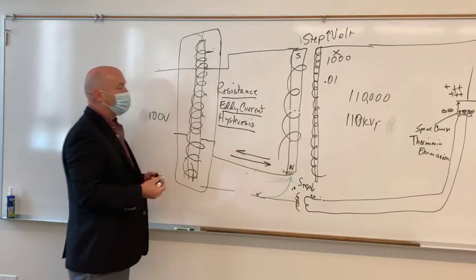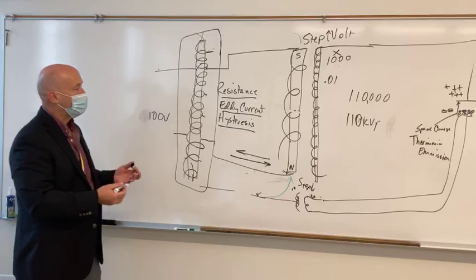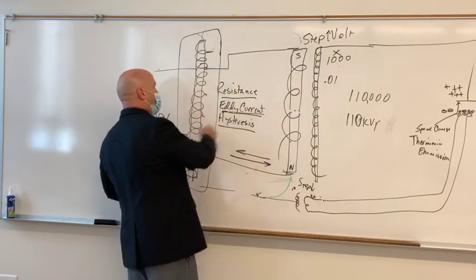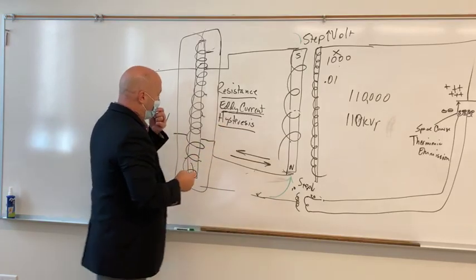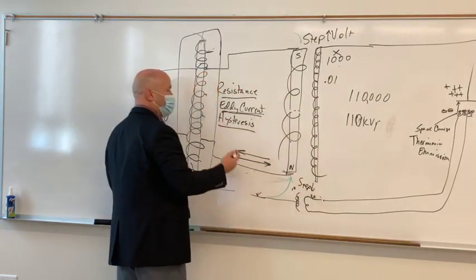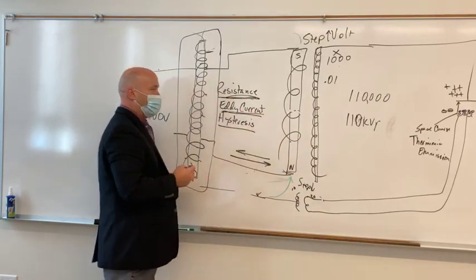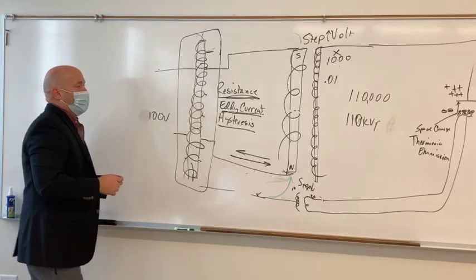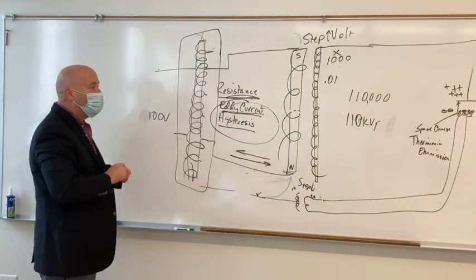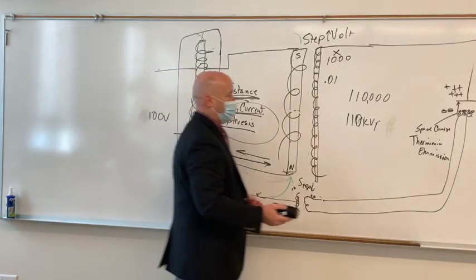And we're gonna deal with them in different ways, you know. We added the core to reduce eddy currents. We added, especially in the high voltage transformer, the oil to reduce just resistance in the wire, the heating of the wire. But back to these two, we can improve our efficiency in these things with different types of transformers.